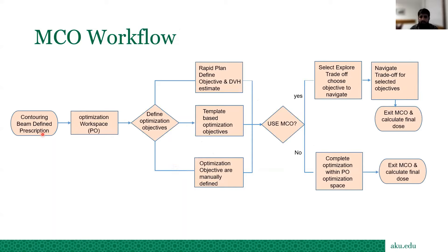This is the typical workflow: contouring, beam definition, and prescription — which is quite important. If you haven't done good medical physics contouring, you may not get a good plan in MCO either. In the optimization workspace, define optimization objectives using one of three options: RapidPlan if you have that license, department templates, or a manual approach. The recommendation is to first make your best plan then go to MCO, although MCO can also create the balance plan directly from the objectives, PTV, and priorities you set.